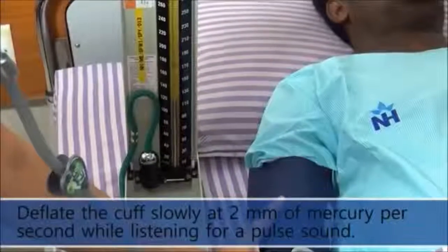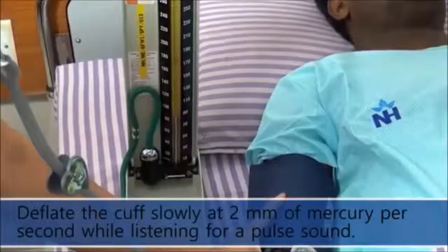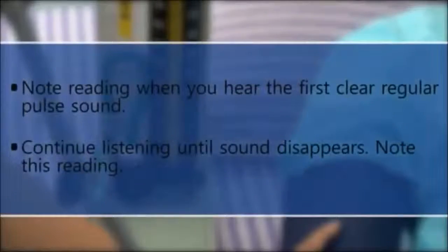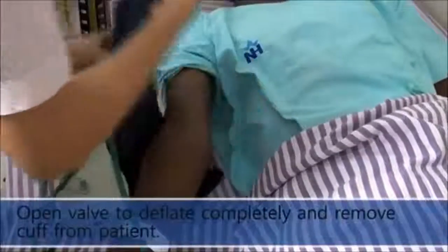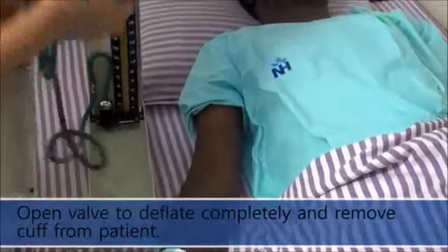Deflate the cuff slowly at 2 mm of mercury per second while listening for a pulse sound. Note reading when you hear the first clear regular pulse sound. Continue listening until sound disappears. Note this reading. Open valve to deflate completely and remove cuff from patient.